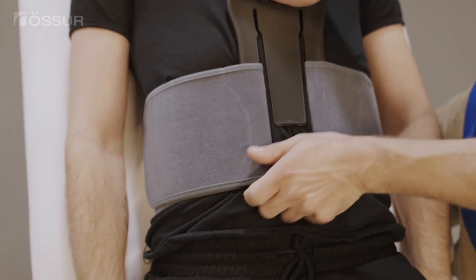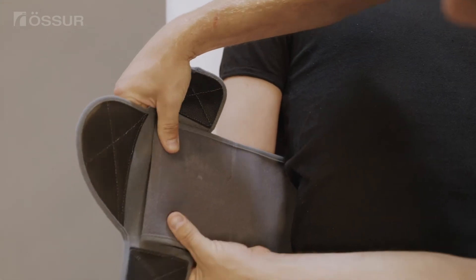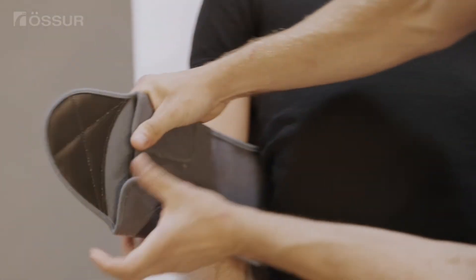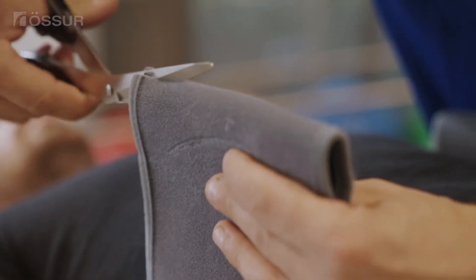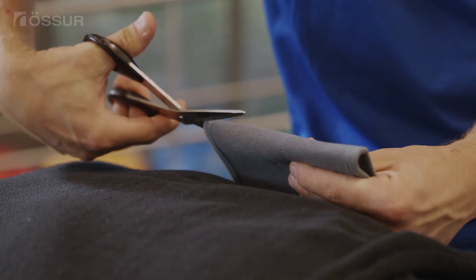Remove the fit tool from the belt. Place belt ends into the overlap closures. Fold the belt arm ends to obtain the lowest profile fit. The belt arm ends can be trimmed if later adjustments are not required.